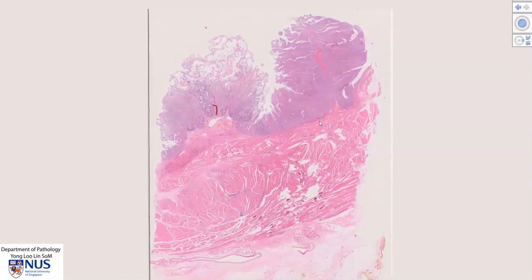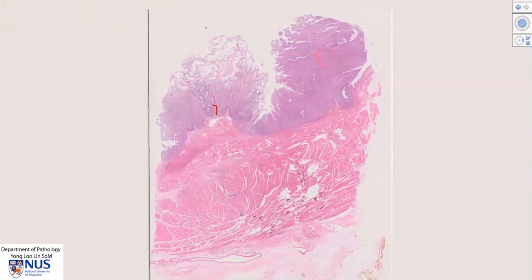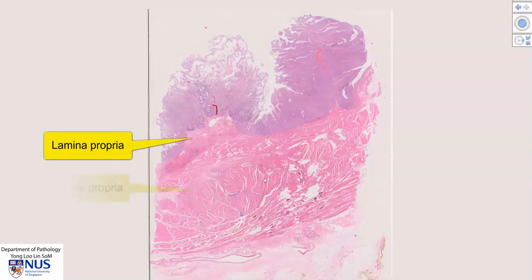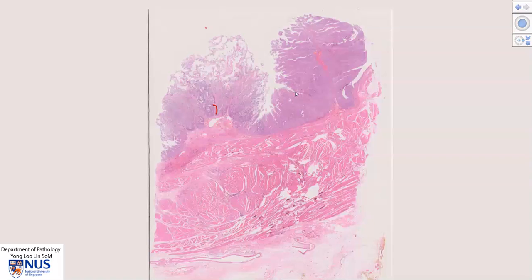Hello, this is a virtual microscopy slide of a case of papillary urothelial carcinoma, high grade, of the urinary bladder. This is a non-invasive tumor and I will just delineate the extent of the tumor here. This is the basalmost extent of the tumor. It is still limited to the urothelium and does not penetrate into the underlying lamina propria, or the thick pink layer which is the muscularis propria or detrusor muscle, and it certainly does not penetrate into the perivesical soft tissue. So this is a non-invasive papillary urothelial carcinoma.